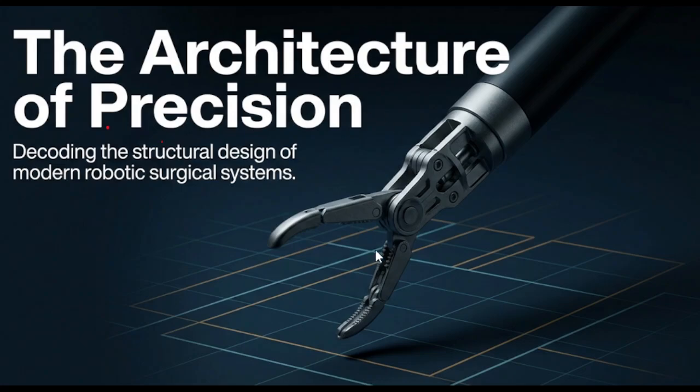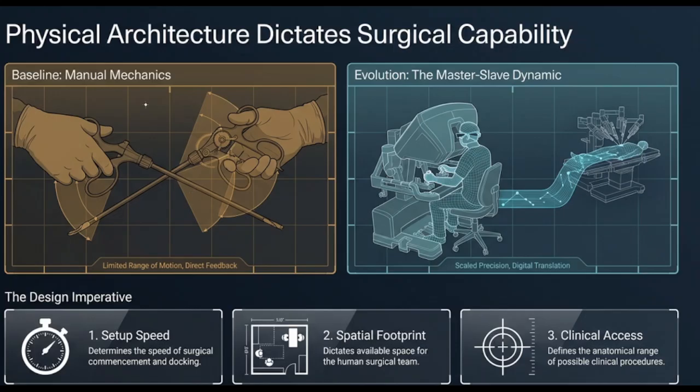Okay, so today we are going to discuss the architecture, meaning the types of robotic surgical systems available in the current market. Okay, so if you see, we have started surgery.